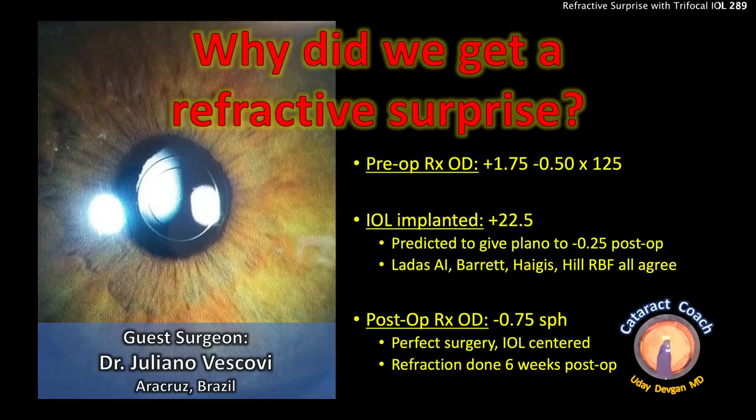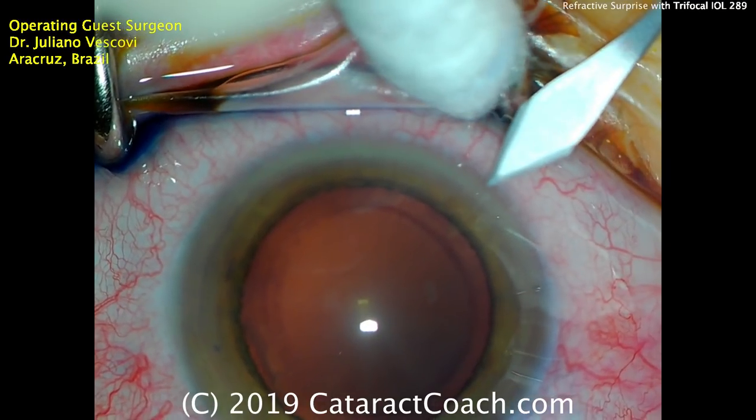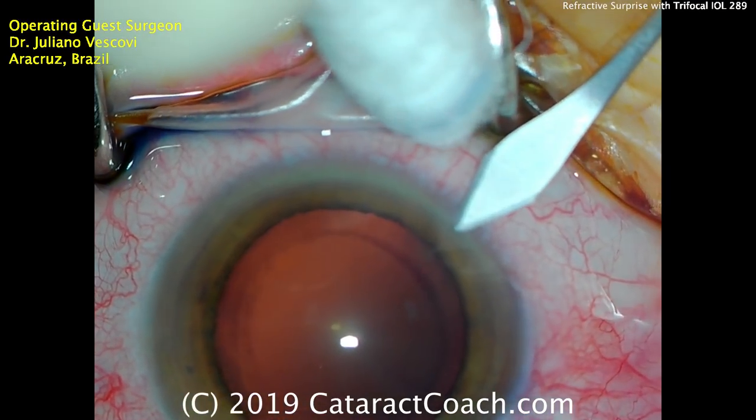CataractCoach.com. Why did we get a refractive surprise with guest surgeon Dr. Juliano Vescovi from Ara Cruz, Brazil? All these different methods indicated that a 22.5 diopter lens would be just about perfect, between plano and minus a quarter. But the patient ended up about minus 0.75. Let's figure out why.